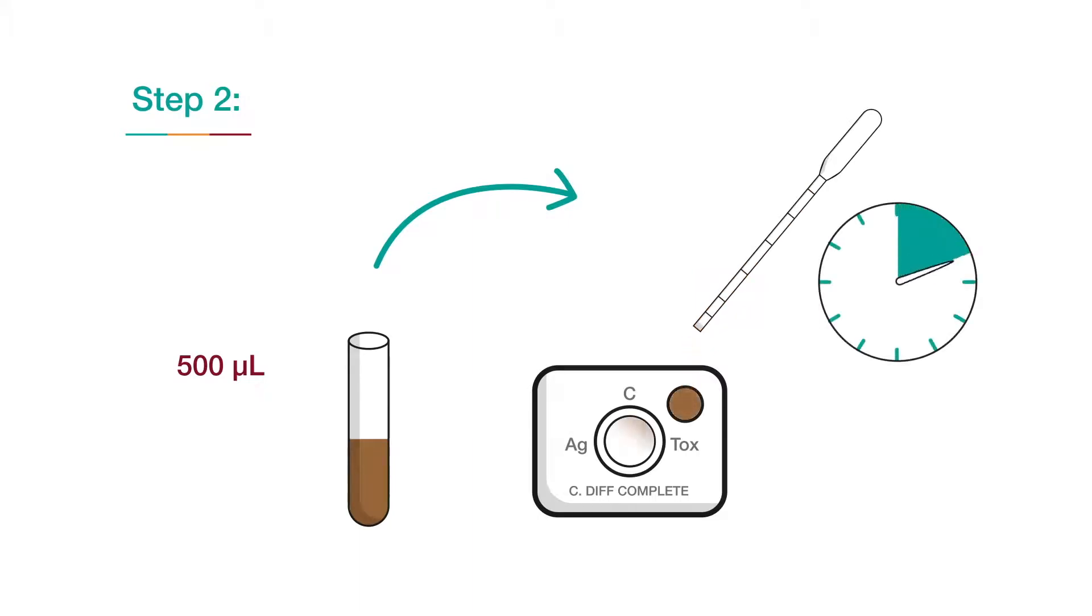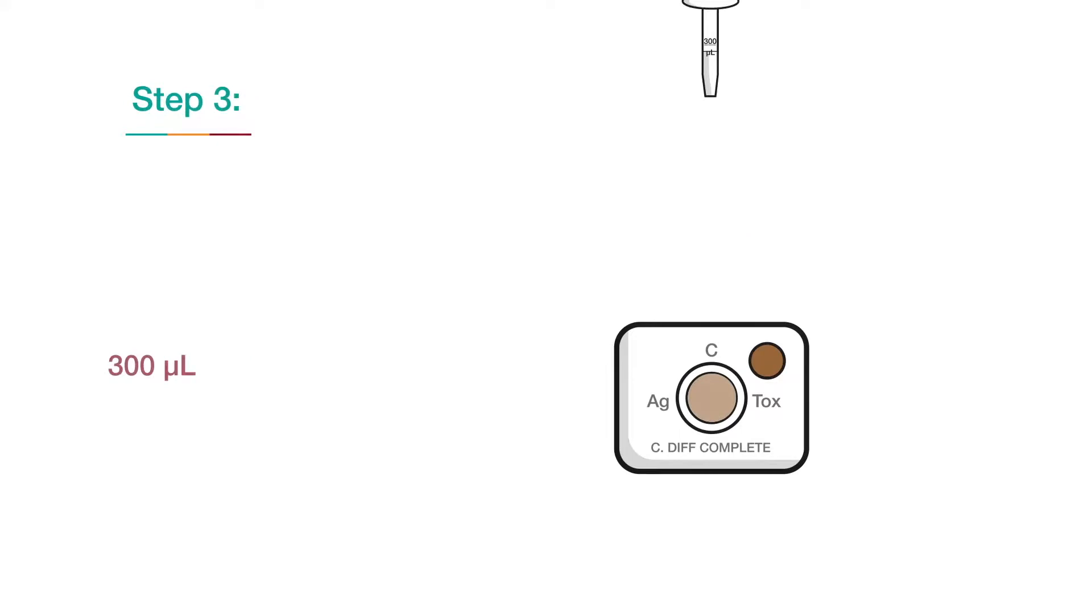Incubate for 15 minutes at room temperature. Add 300 microliters wash buffer to the large reaction window on the Quick Check device.